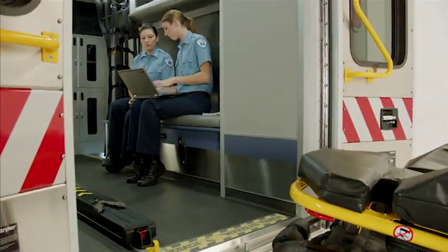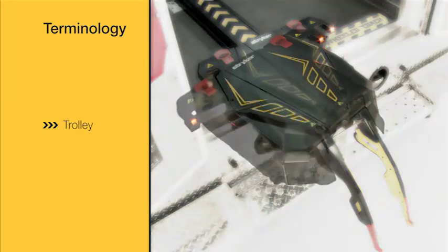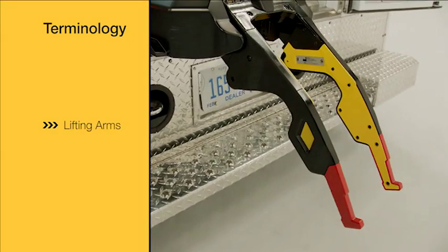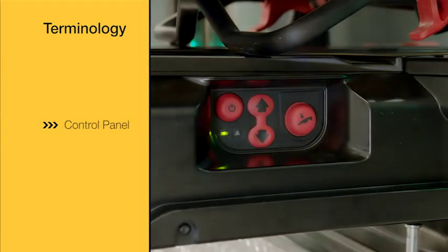As you go through the following Power Load in-service DVD, there are a few items to keep in mind. This is the component we are referencing when we say power load trolley. This is the component we are referencing when we say lifting arms. This is the component we are referencing when we say power load control panel.